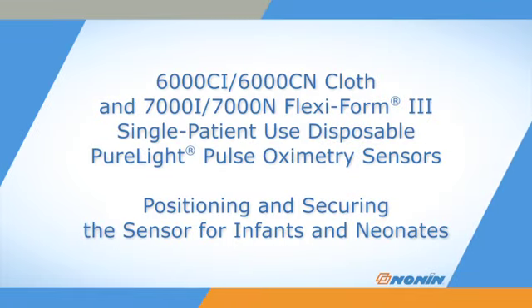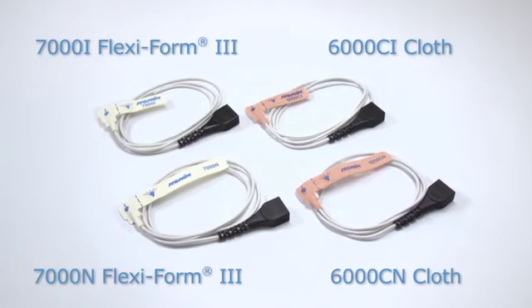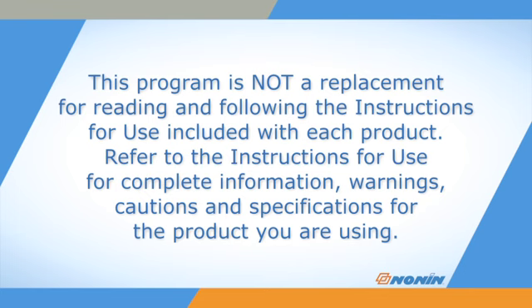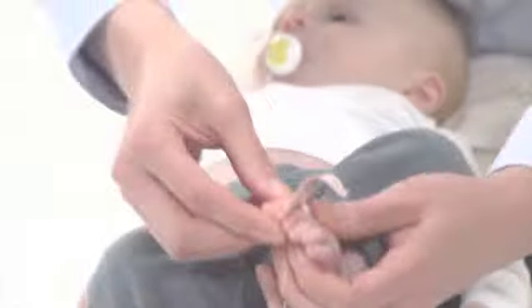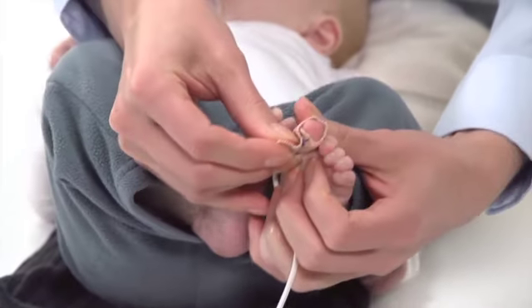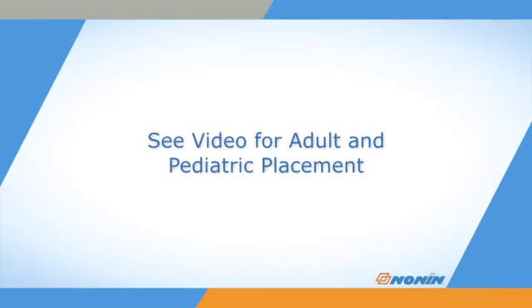This short video shows how to properly position and secure Nonin 6000Ci and CN series cloth and 7000i and 7000N Flexiform 3 series sensors for infants and neonates. These cloth and Flexiform 3 series sensors are a one-piece sensor with an integrated cable designed for single patient use. They are designed to secure the sensor in position on the foot or toe without additional tape. These sensors may also be used for adult or pediatric finger oxygen saturation and pulse measurement. See the video for finger use for placement instructions.